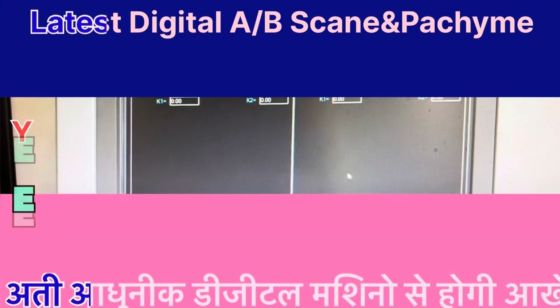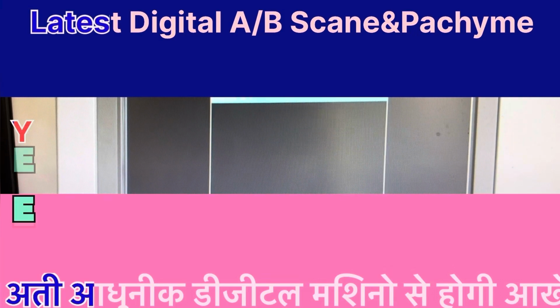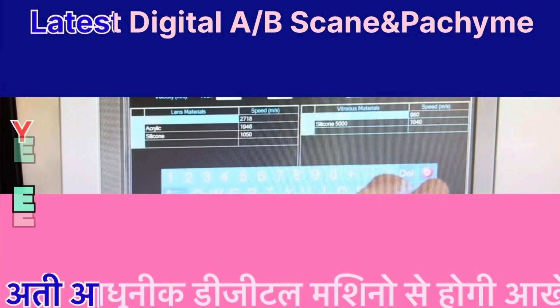A startup screen is displayed when the system boots. A user profile can be chosen and modified by selecting Physician Setup from the bottom toolbar. Selecting New Physician creates a new user file.